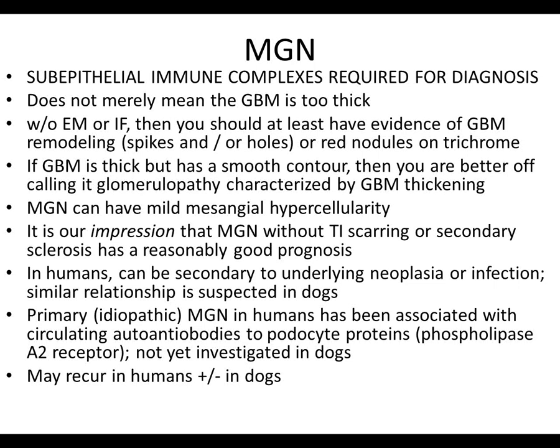means that if they activate the complement system, they're not going to attract inflammatory cells. And that's the basic difference between membranous and what we'll see later with membranoproliferative. So when they're on the outside of the capillary loop, there is very little chemotaxis or attraction of inflammatory cells because they're not in a location that can induce that response.